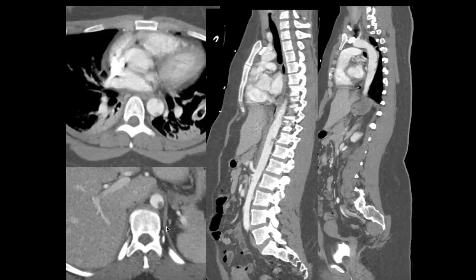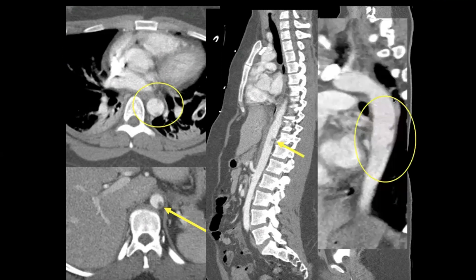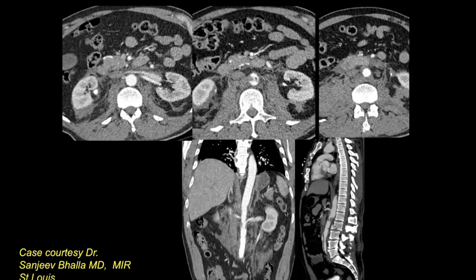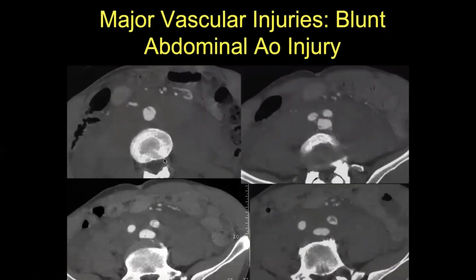Injuries of the upper abdominal aorta in Zone 1 may often be associated with intrathoracic injuries, as in this case with several intimal flaps in the descending thoracic aorta. This patient was also treated medically. In this example, there is a dissection of the abdominal aorta with an extensive retroperitoneal hematoma and associated distraction injury of the lumbar spine. This is an example with an injury at the bifurcation and dissection involving the bilateral iliac arteries and extensive retroperitoneal hematoma in a patient that was treated surgically.